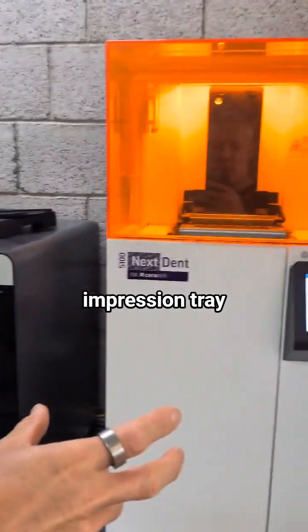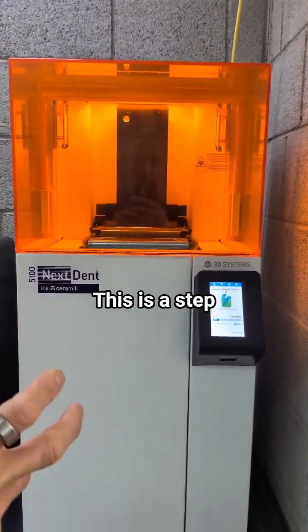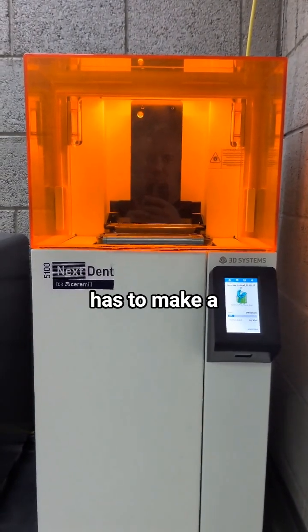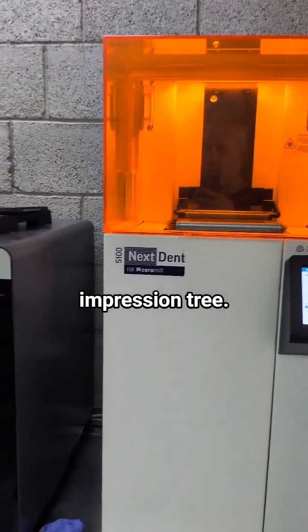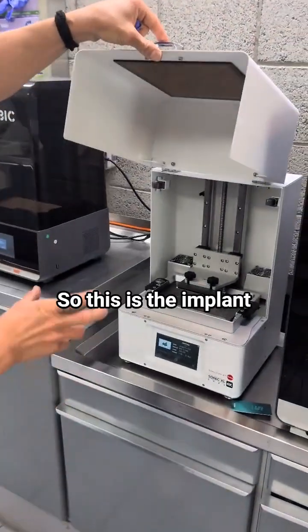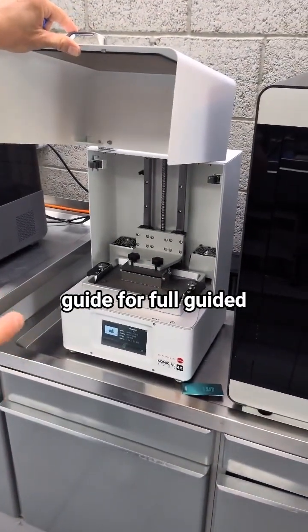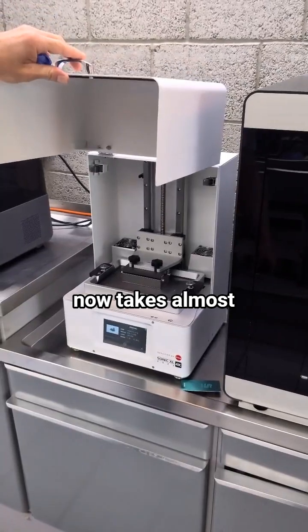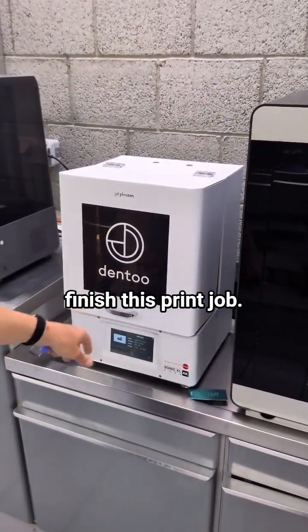This is an impression tray for taking an impression — a step used when we do removable prosthetics. The dentist has to make your impression with an impression tray. There are prints running right now. This is the implant guide for full guided implantology, and it's already printing. It takes almost two more hours to finish this print job.